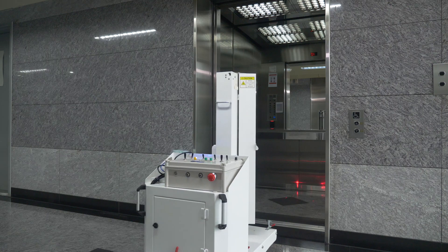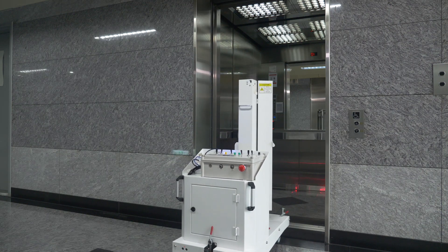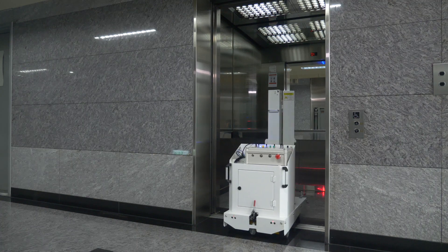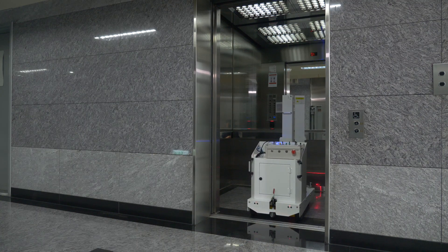The Cello UVC robot can take elevators to navigate to other floors by connecting to the wireless elevator controllers of the building management systems.